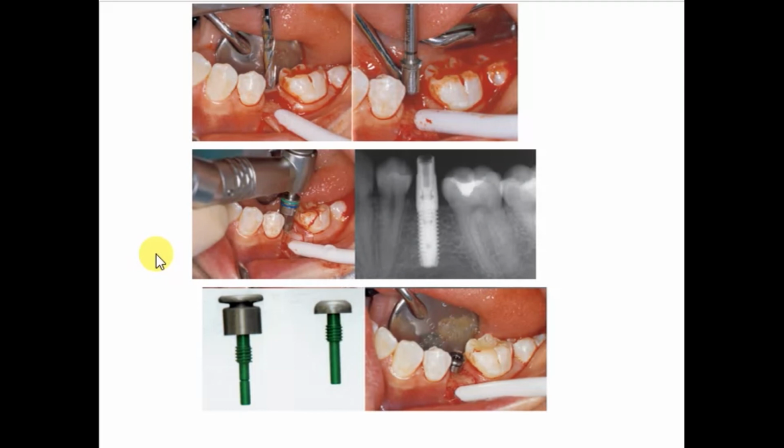The advantages of the one-stage surgery are: the soft tissue matures while the bone interface is healing. This permits the restoration to be fabricated with complete assessment of the soft tissue profile. In the two-step procedure, the soft tissue is less mature when the prosthesis is fabricated, as a stage 2 surgery is required to uncover the implant and place a PME or abutment, as we discussed.